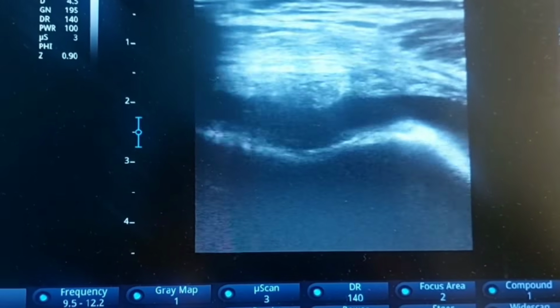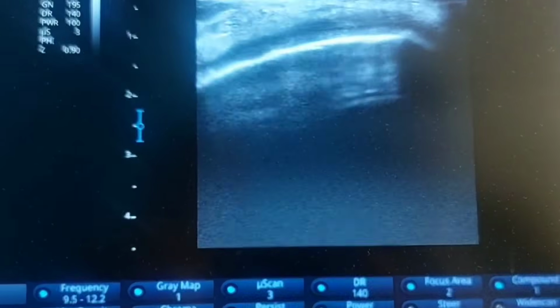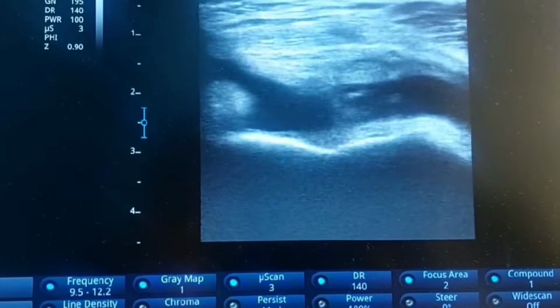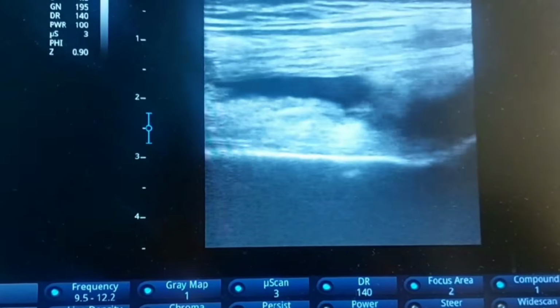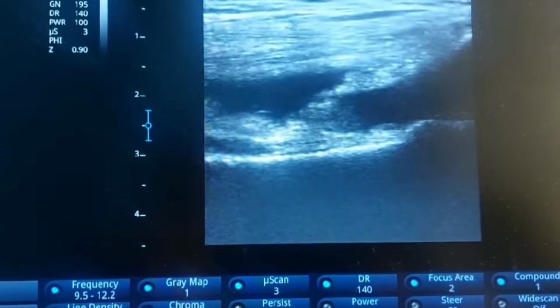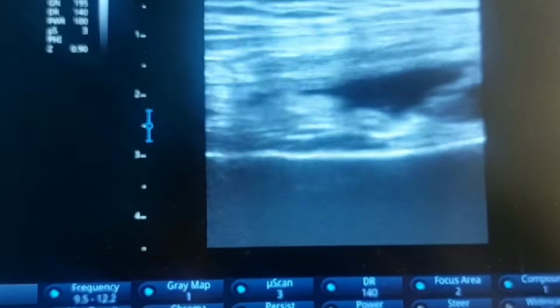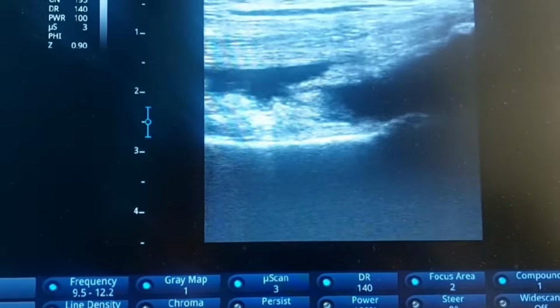It could be because of infection, it may be because of lipohemarthrosis, and it may also be because of lipoma arborescens. So you need to have the patient investigations and history with you. You must comment on the quadriceps tendon, you must comment on the myotendinous junction.